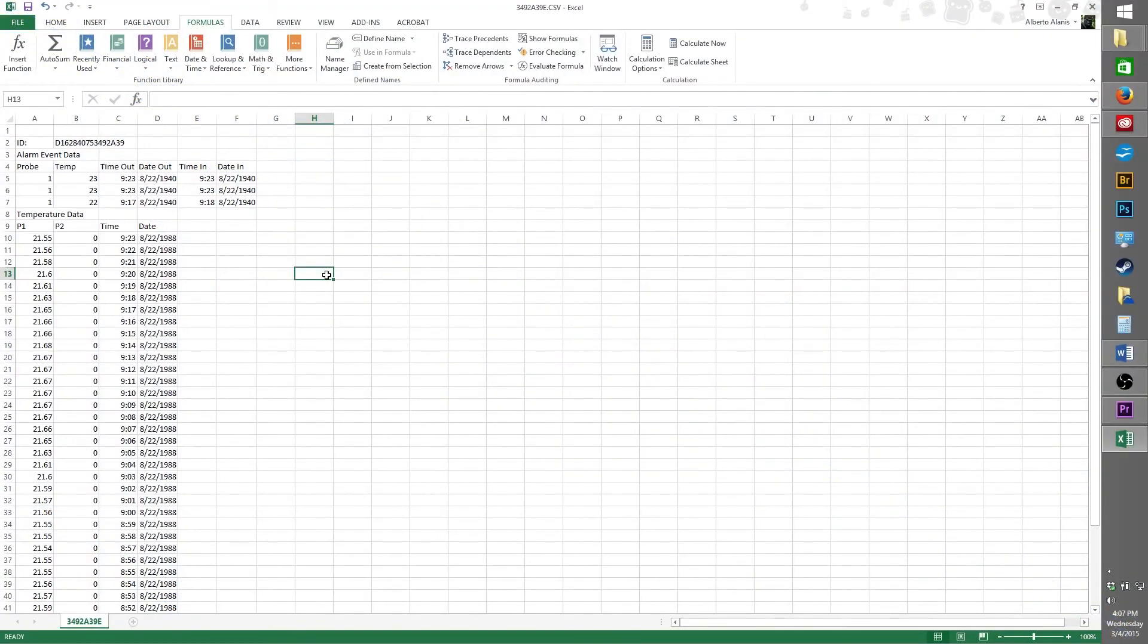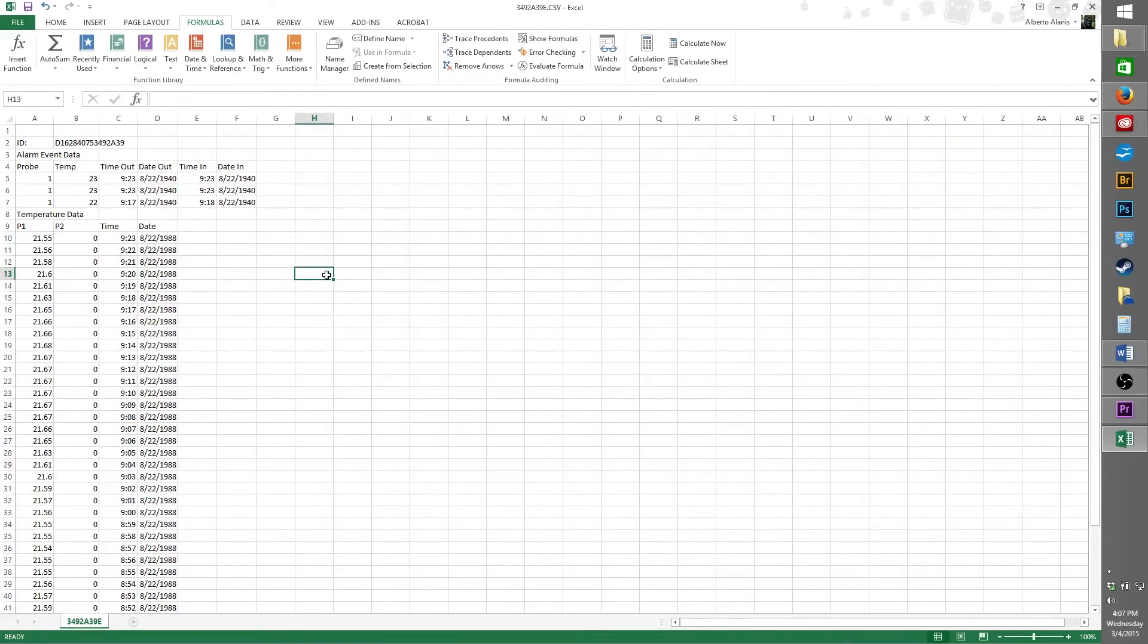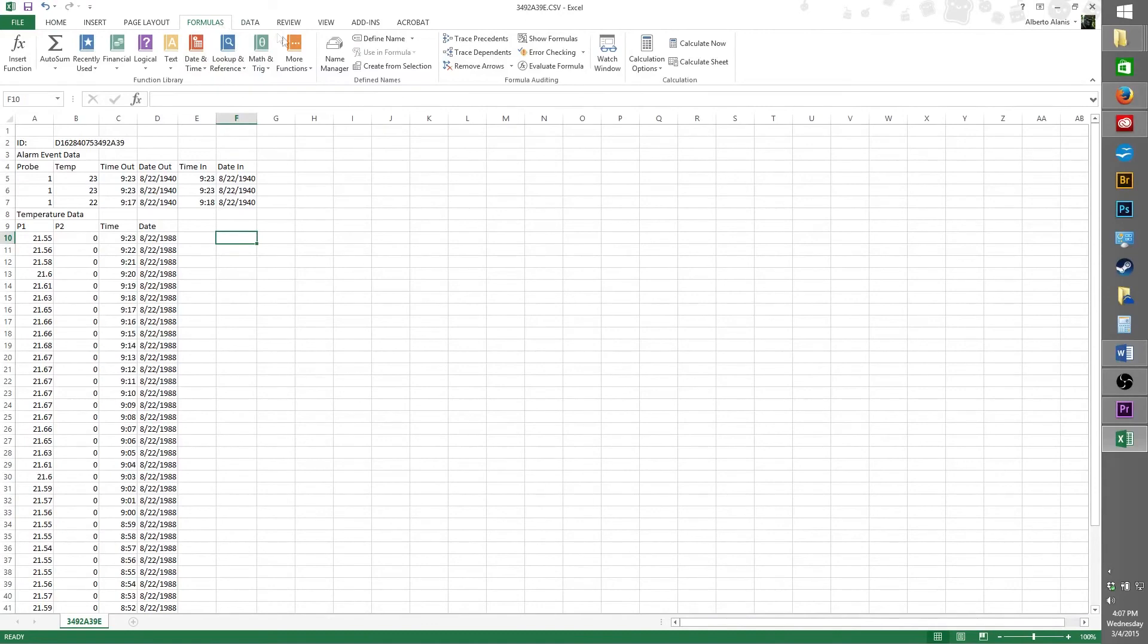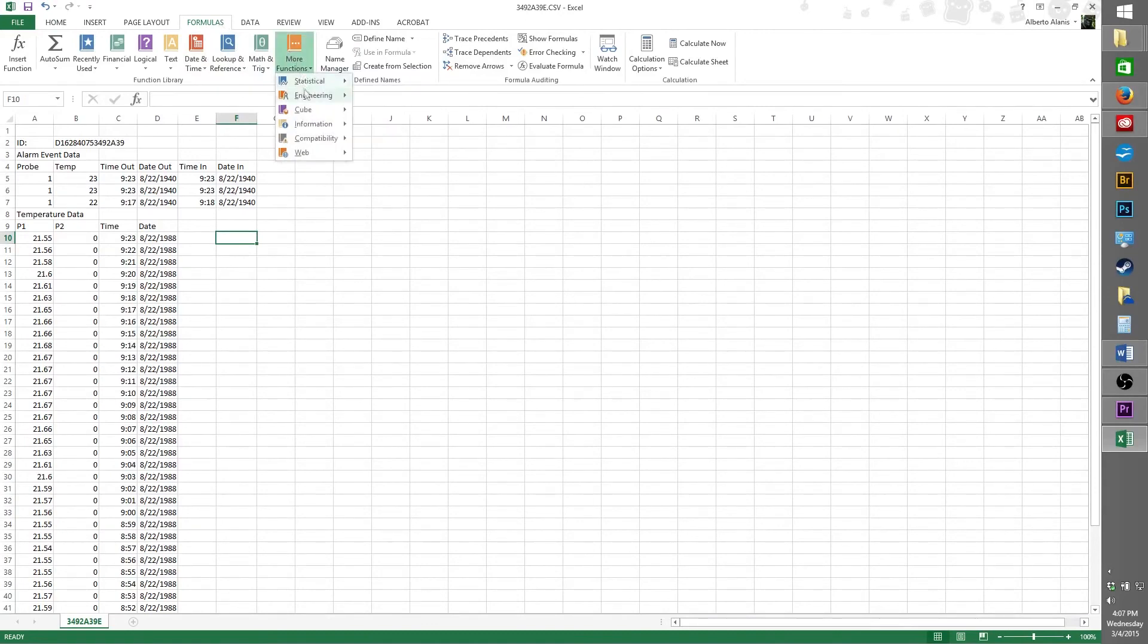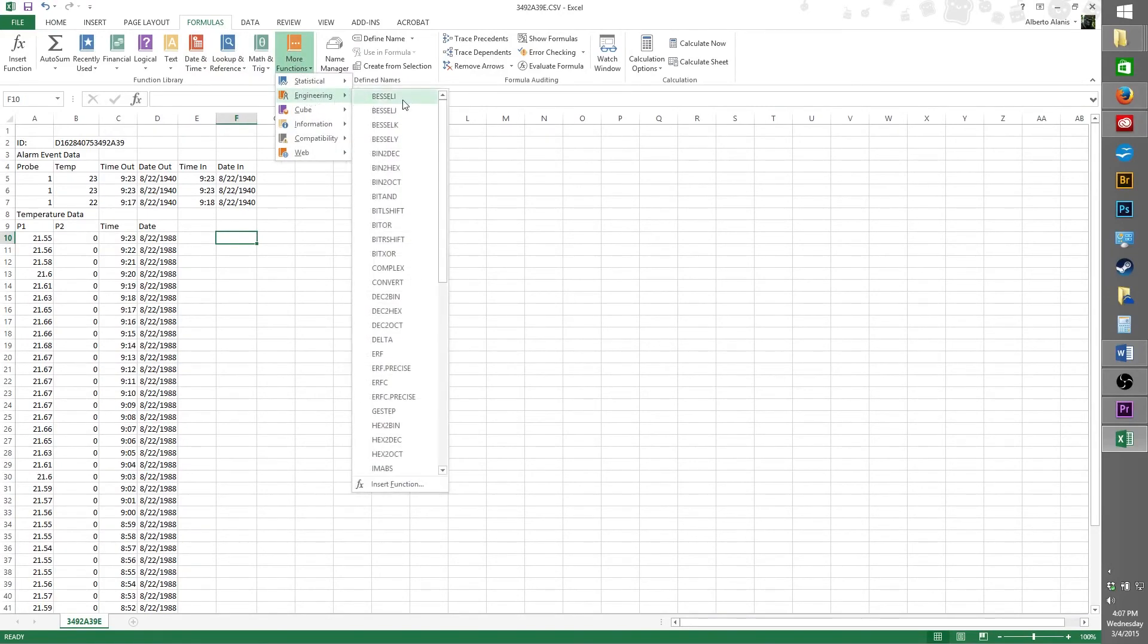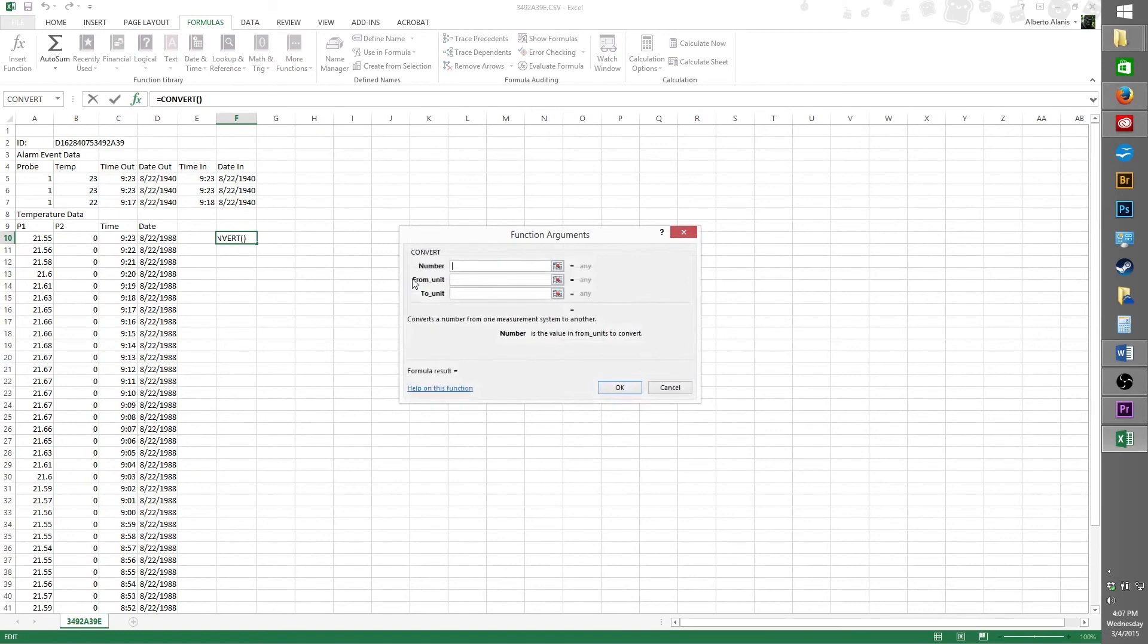Your spreadsheet will always display its temperature readings in Celsius. If you prefer Fahrenheit, there's a way for Excel to perform this test for you. Here's how you do it. First, click a space away from your date so we can get some separation. Then go up top and click on the formulas tab, and then look for more functions. Go to engineering and then choose convert. A pop-up box will appear that will help you accomplish your function.